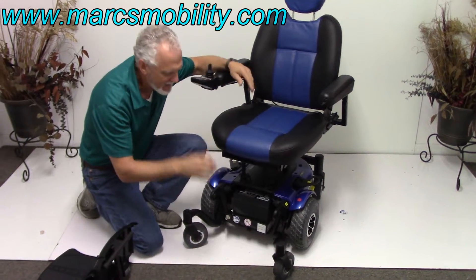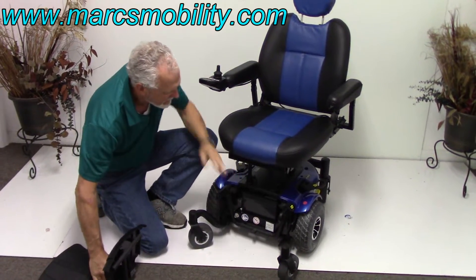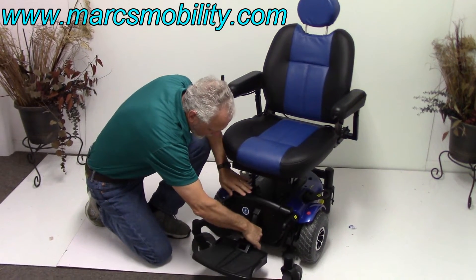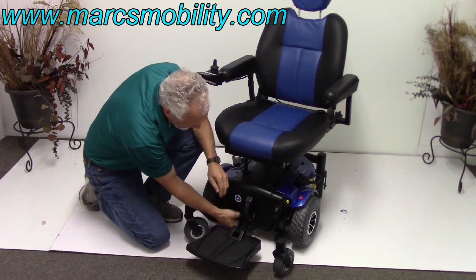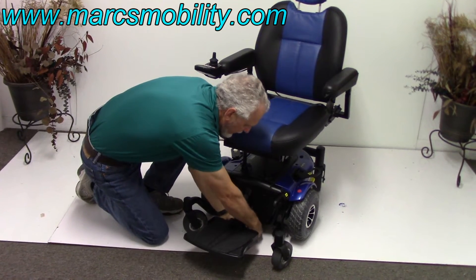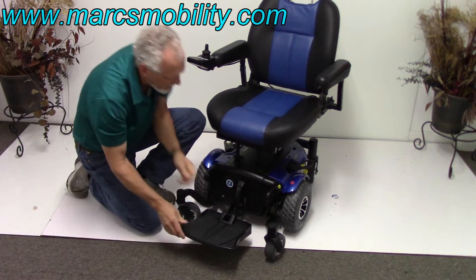This will give you 15 miles on a battery charge. That's where your batteries are and how they come out when you want to change them. You just put the tray back in, put your clip back in, and you're ready to go.